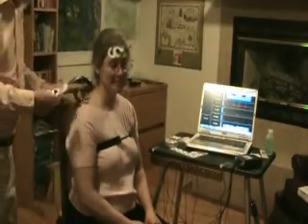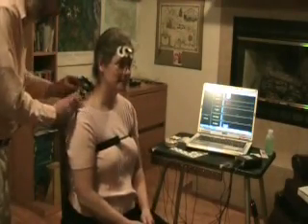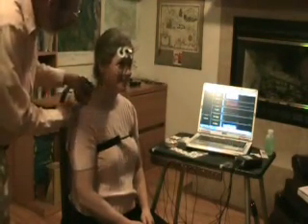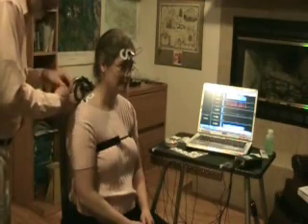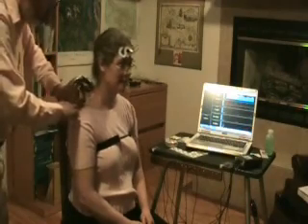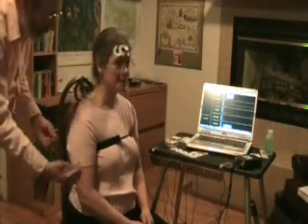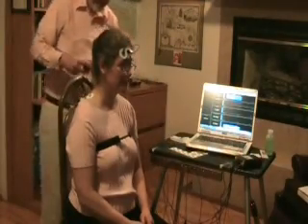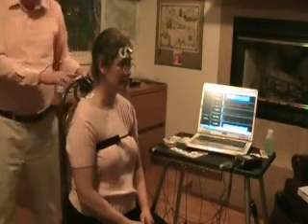The next sensor leads are going to go right here. You're fine. Okay. Everything's out of the way. This is just going right across your head now. And we'll tape it out of your way. Next thing we're going to do is we're going to see whether the muscle tension leads work.